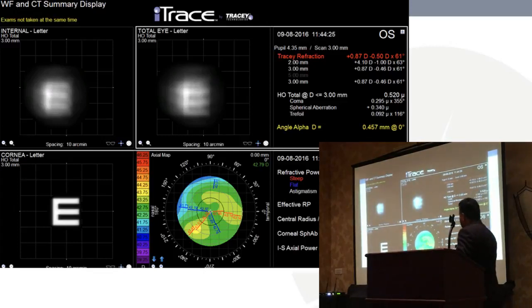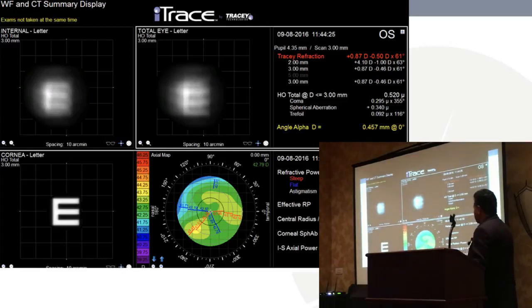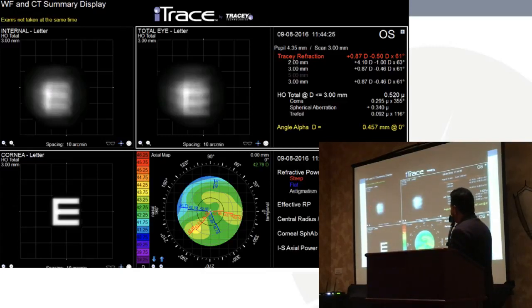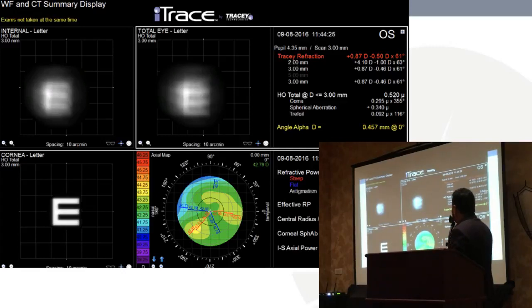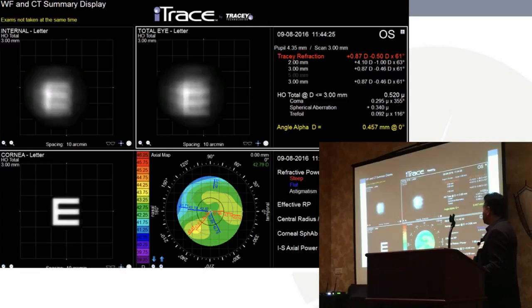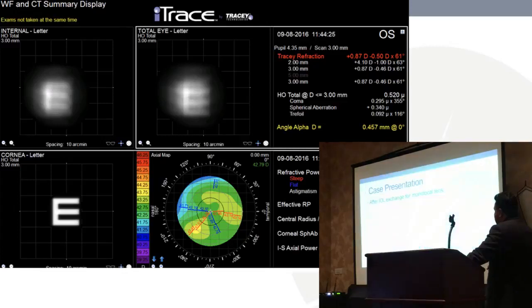If we look here, you see the corneal map and the Snellen equivalent of what the patient might see — this is very intuitive for patients. The cornea looks pretty good. But when you look at the internal aberrations, you see this pattern. We can isolate exactly where the aberrations are coming from, and it's a fantastic patient education tool.